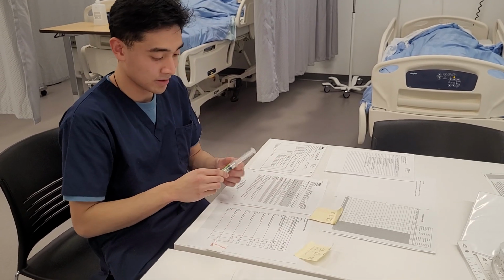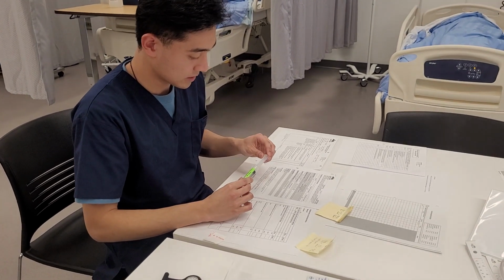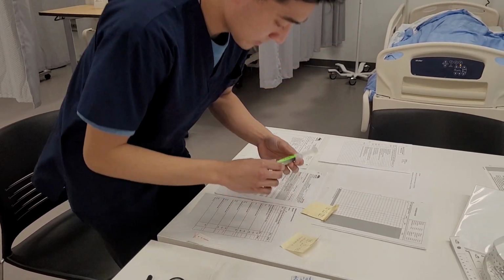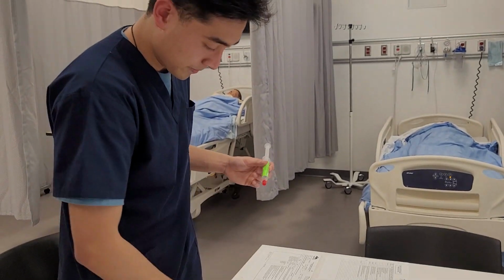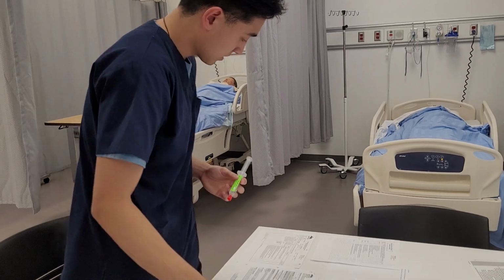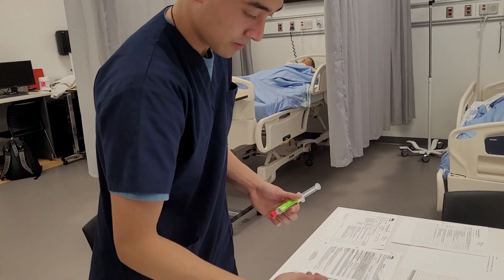Okay, we'll just leave it at that. I'm also going to be checking the expiry date, so it's not expired, so that's good. Alright, so it's ready to gather all my equipment.